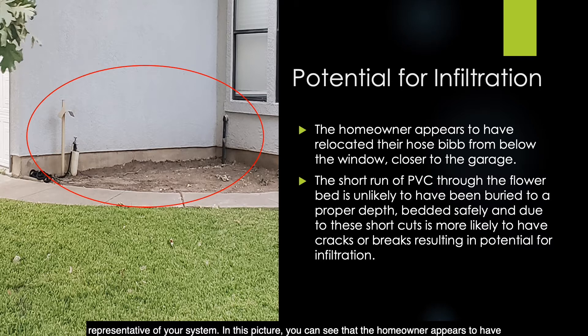In this picture, you can see that the homeowner appears to have relocated their hose bib from below the window closer to the garage. The short run of PVC through the flower bed is unlikely to have been buried to a proper depth or bedded safely, and due to these shortcuts it is likely to have cracks or breaks resulting in potential infiltration. This is not an ideal sample site for representing the bacteriological quality of your system.